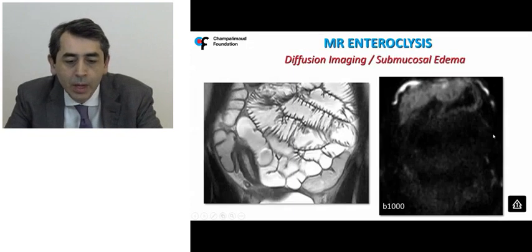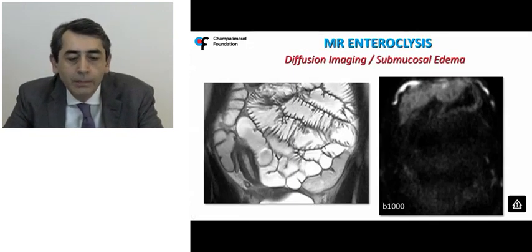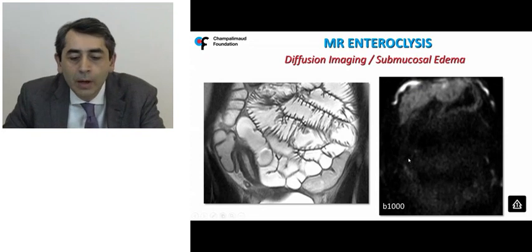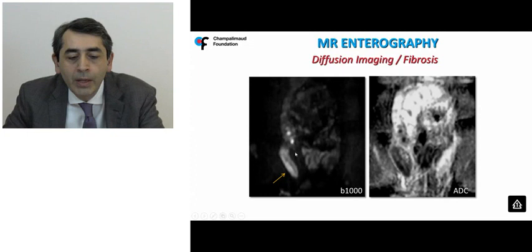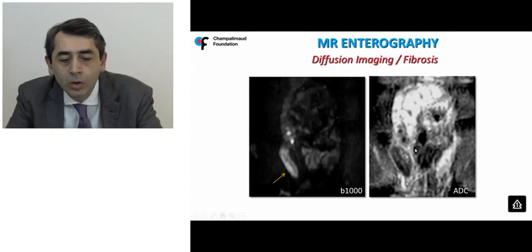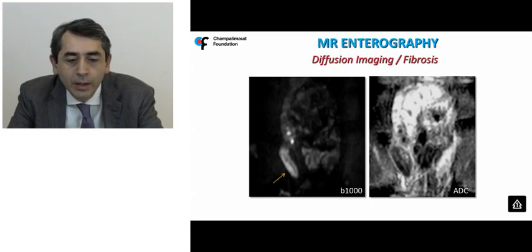For wall thickening characterization, one may expect absence of bright signal intensity on B1000 when dealing with pure submucosal edema, or maintenance of bright signal intensities in the case of fibrosis. However, this is not a black-and-white situation, because most of the time there is coexistence of inflammation and fibrosis, and therefore diffusion may be of limited help when quantifying ADC values.